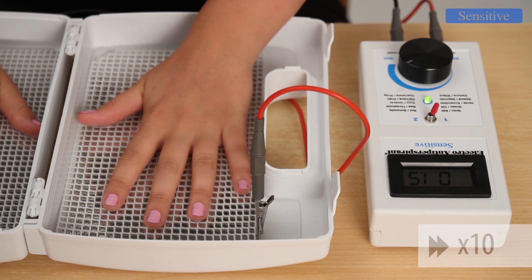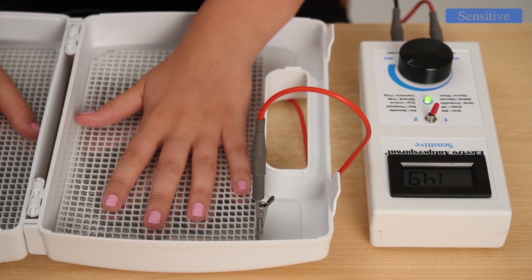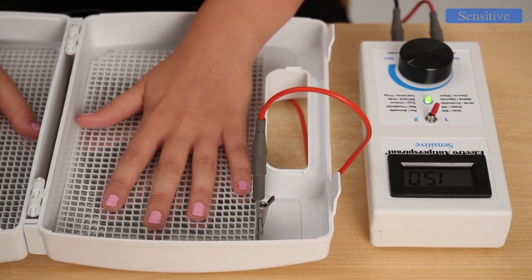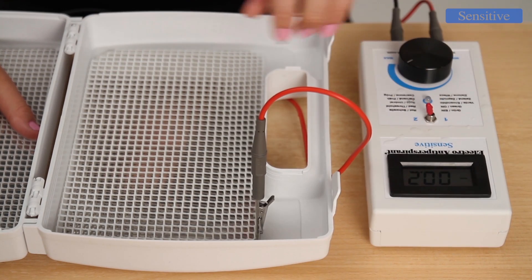After dipping your limbs in water, the green LED goes on and the display shows a low numerical value. Wait approximately 40 seconds, during which time the device evaluates your electrical resistance and selects the most suitable way of therapy. After this time, Electroantiperspirant Sensitive automatically increases the intensity to the desired value. After the required time of therapy, remove at least one hand from the container and set the switch from value 1 to value 2. Then put your hand into the water again and repeat the process.